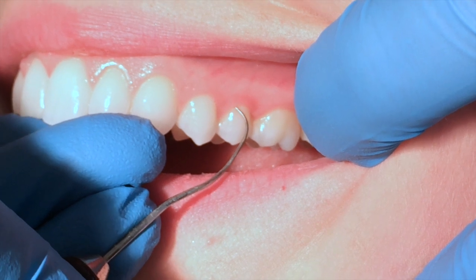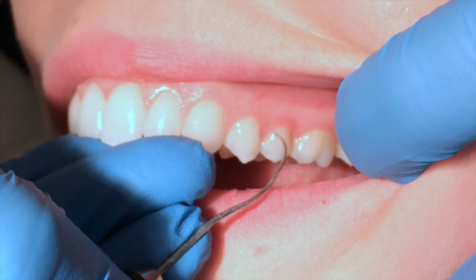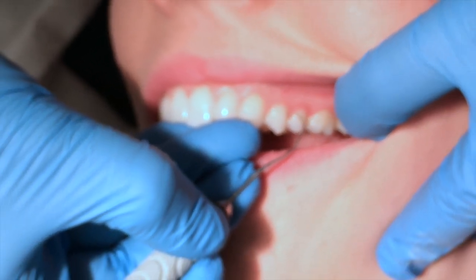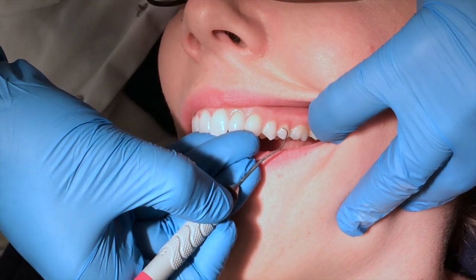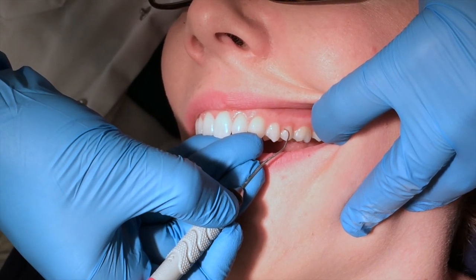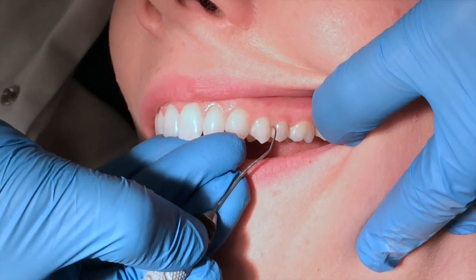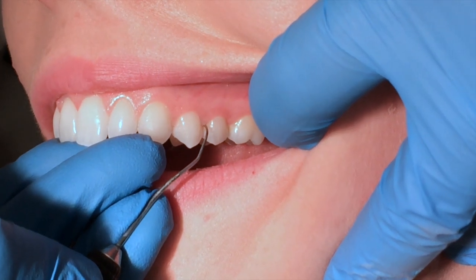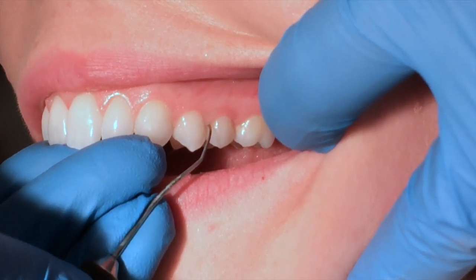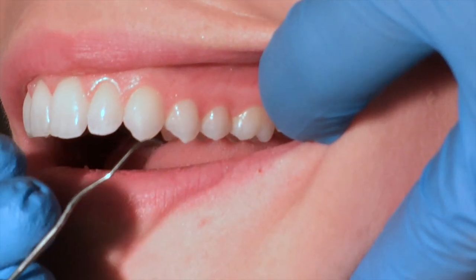I'm using a very, very light stroke. My thumb is popped out in a modified pen grasp, and I'm using my thumb and my pointer finger to roll to access those line angles. Extending interproximal under the contact — not stopping until I'm under — and then lifting up, hitting that contact.